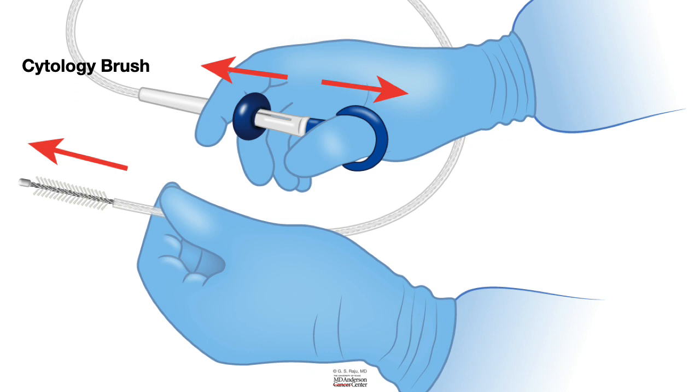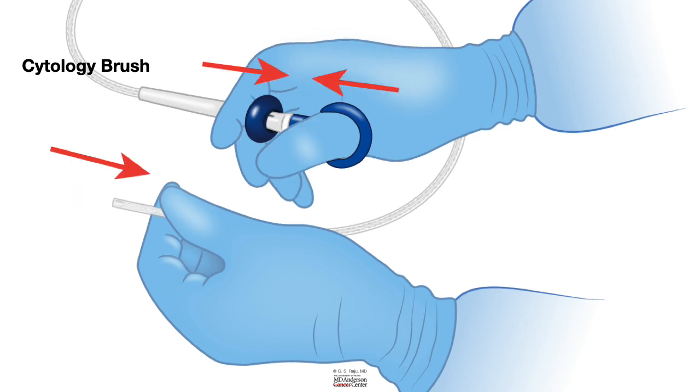When the brush comes out, it is in an open position. And when you close your grip, the brush goes back. As you can see here, it is very simple. So, as long as you hold the handle in a proper way, opening and closing your right hand on the handle operates the brush — brings it out, or takes it back into that sheet.